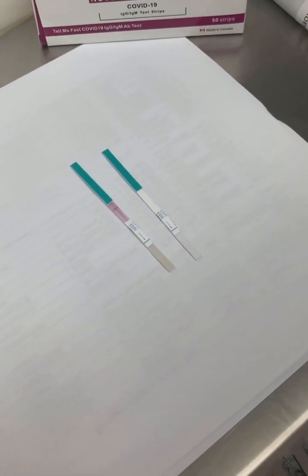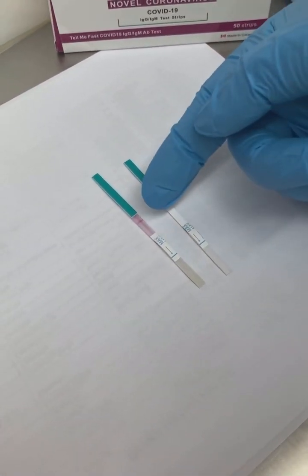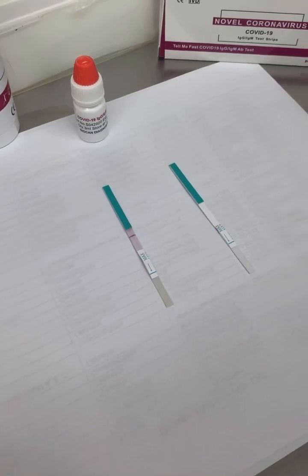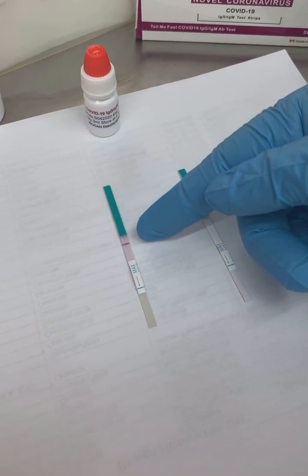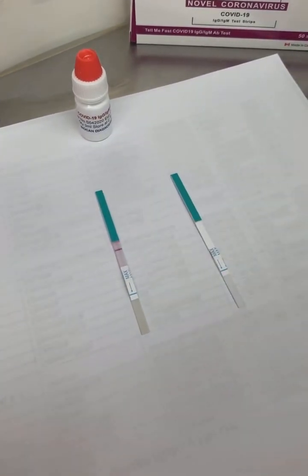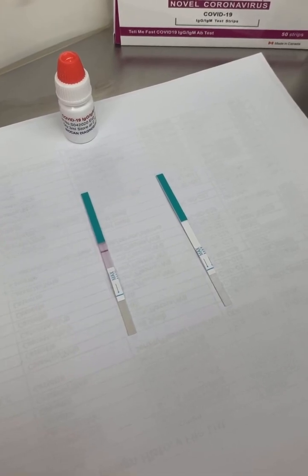As the sample flows through the test strip you can see the appearance of the control line. You can read the results at 10 minutes. One line in the control area indicates a negative test. No COVID-19 IgG-IgM antibodies were detected.